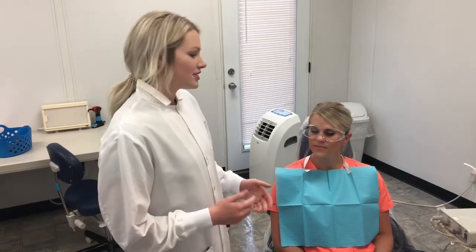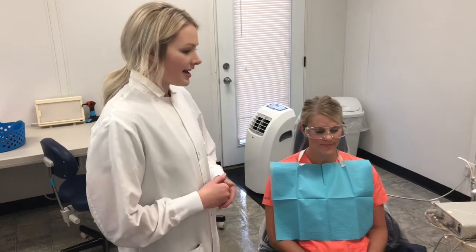Today we're going to demonstrate how to apply a fluoride tray application here at UCDH. First, I'm going to make sure that my patient is seated upright and explain the application procedure to the patient.